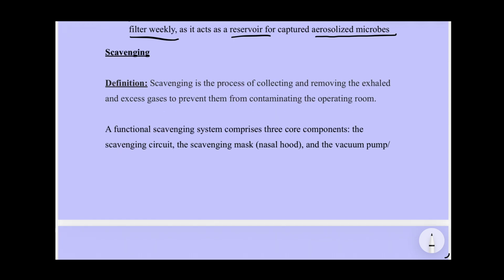Nitrous oxide is a highly effective inhalation sedative, but because it is not metabolized by the human body, it is exhaled entirely unchanged into the surrounding environment. This creates a profound occupational hazard for dental professionals. So research indicates a staggering disparity in ambient air quality based on equipment choice.